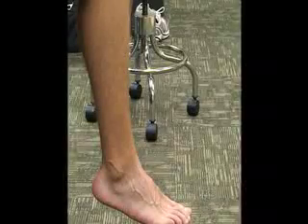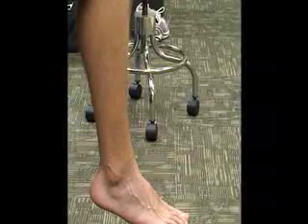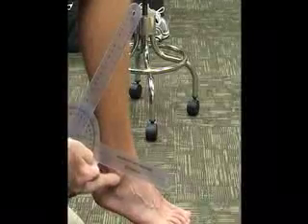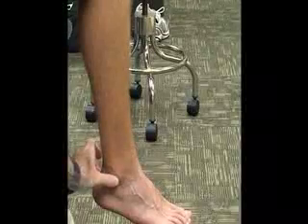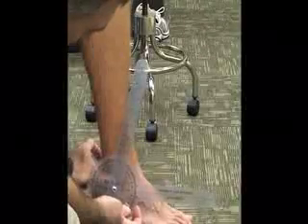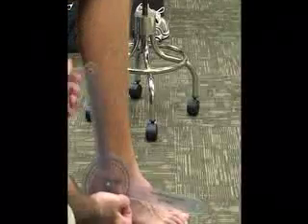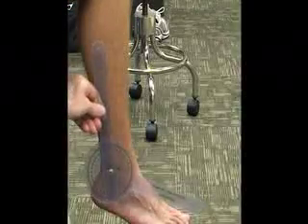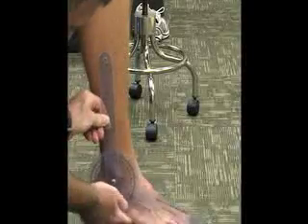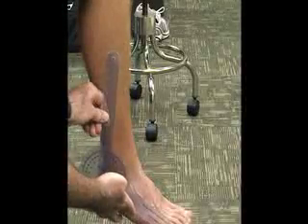We can also ask him to stabilize his knee so he can hold his knee to help us out. For this one, we're going to use a large goniometer and we're going to find our lateral malleolus — the midpoint of that is going to be our fulcrum. Our stationary arm is going to go up along the fibula, and the moving arm is going to be in line with the fifth metatarsal, just parallel to that.